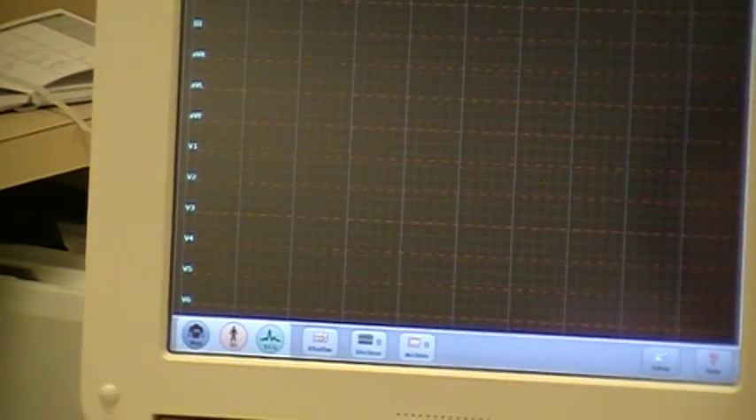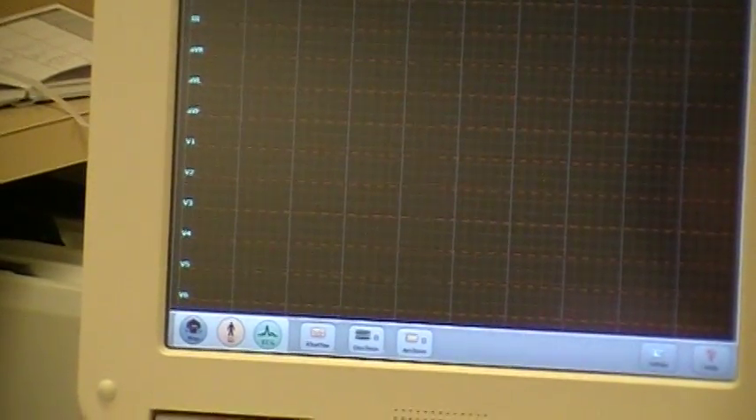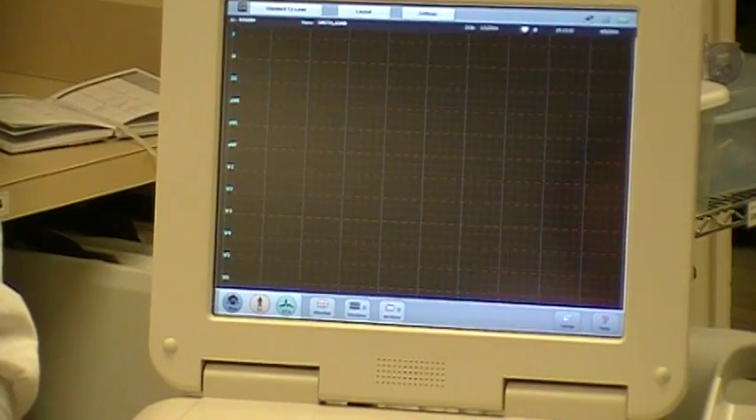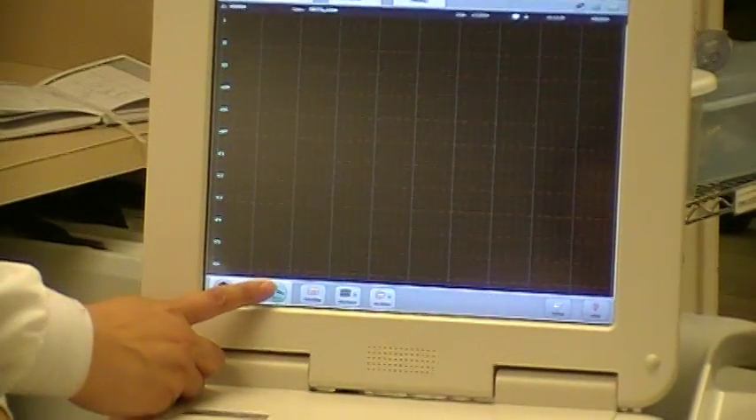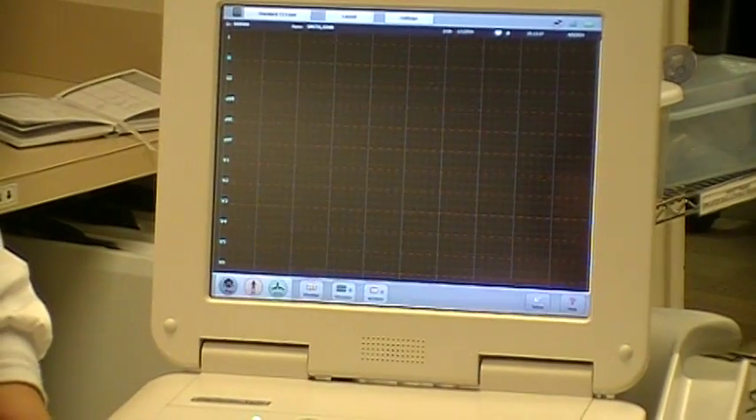A yellow or an orange area means there is artifact being detected. You want to wait until all areas of the EKG are green, and that will give you an EKG that is most easily read.